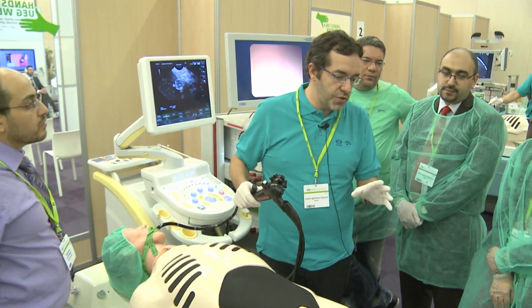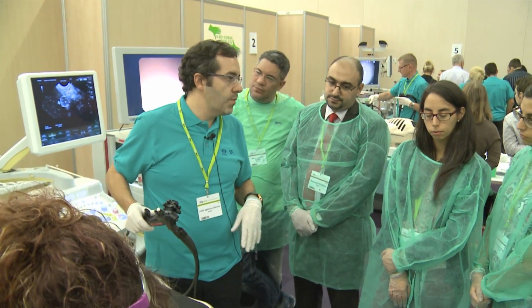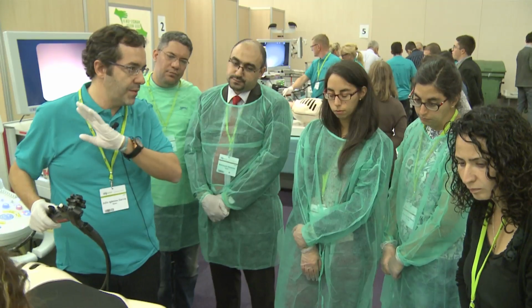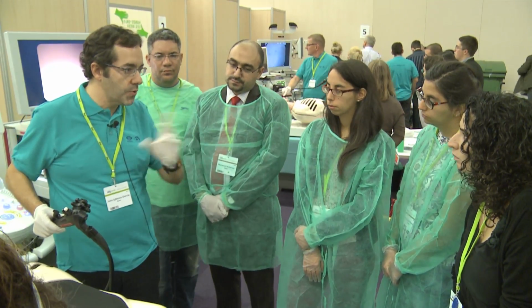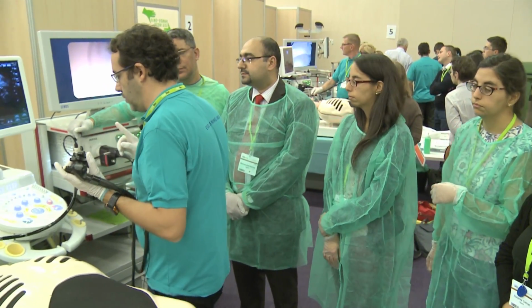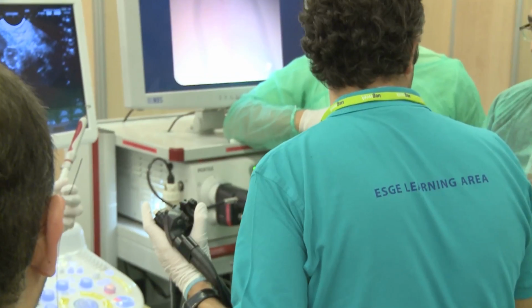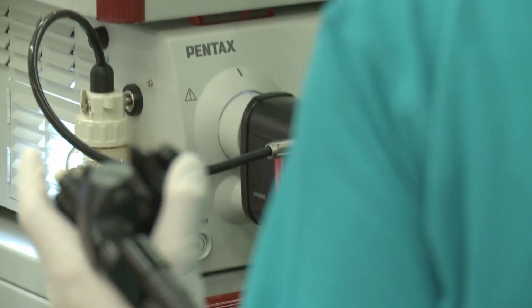Procore needles and cytological needles are almost exactly the same in terms of use. There was some difference when we used the Trucut needle, but we are not using it anymore. For this kind of needle, the system is almost the same. There's only one small difference at the beginning of the puncture that I will show you. We can discuss a lot of things about the technique, suction or no suction, stylet or no stylet. Honestly, it doesn't matter. If you have a good pathologist, all the parts of the technique are equally the same.